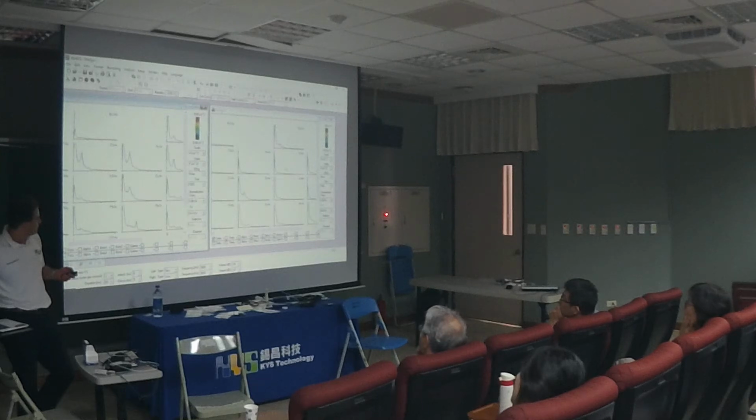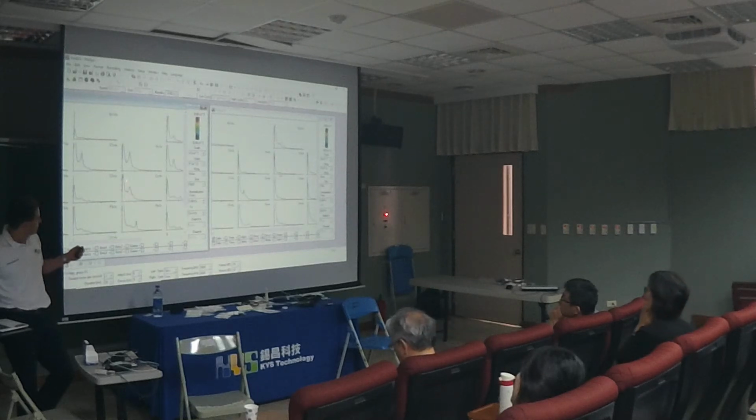And look at FZ. So you can see that the neurofeedback was able to suppress the activity.